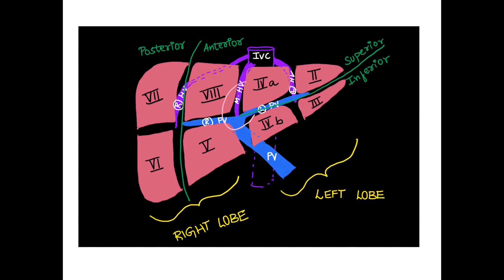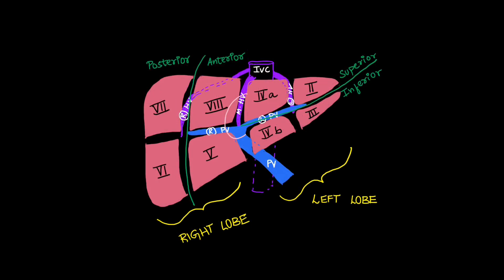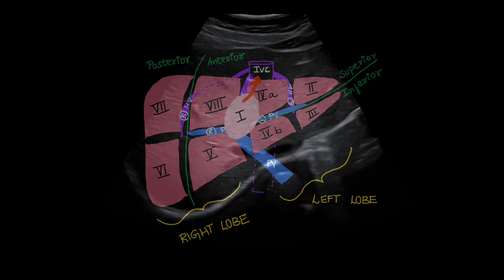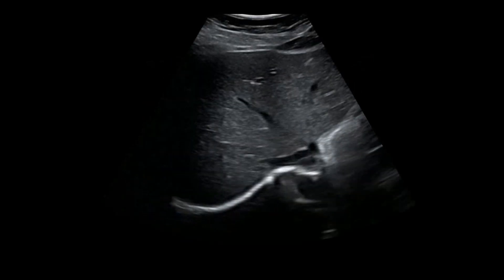The only segment not yet covered is the caudate lobe, also labeled as segment 1. The caudate lobe lies along the inferior surface of the liver, almost along the middle hepatic vein. It drains directly into the IVC and is not drained by any of the three hepatic veins.